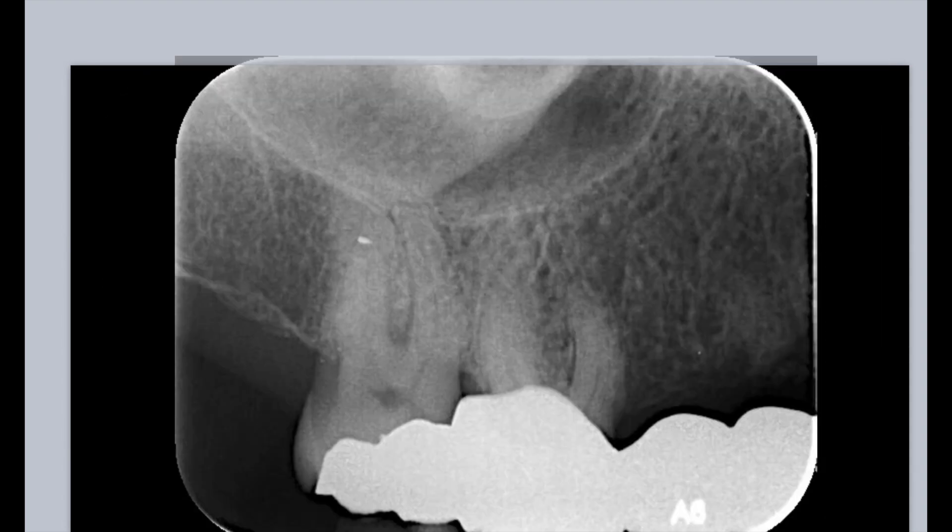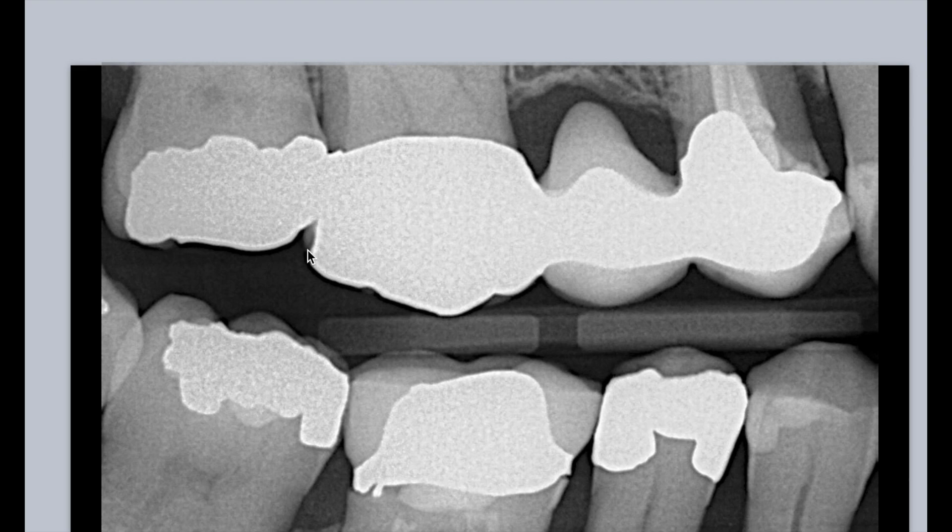Let's take another look in the patient's chart and see if there's another one. This is a Zirconia Bridge, tooth number 16, tooth number 17. You still can't see the pulp chamber, so you think, how am I getting into this case? But one of the tips that I was taught a long time ago was just take a look at the bite wing.